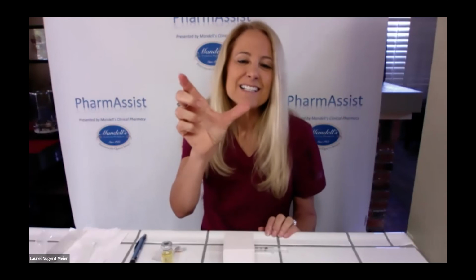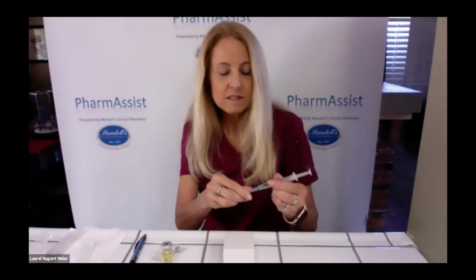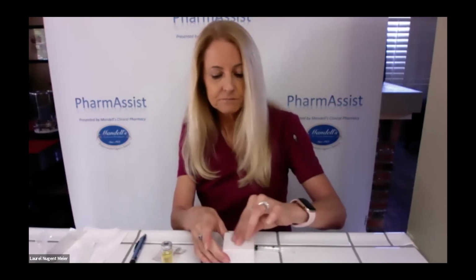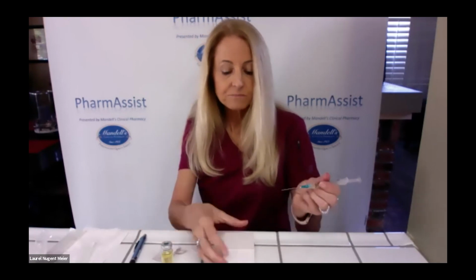What that is, is tickling the skin next to the site while you're injecting. And what that does is it takes advantage of the gate theory, the gate nerve theory, by distracting your skin into not feeling the poke. So it's really nifty and it works pretty darn well. So using one of those techniques, I'll use the tickle technique just to show you how it works. Before I take that off, I'm going to alcohol my skin a little bit and let it dry. And then you're going to give your shot.